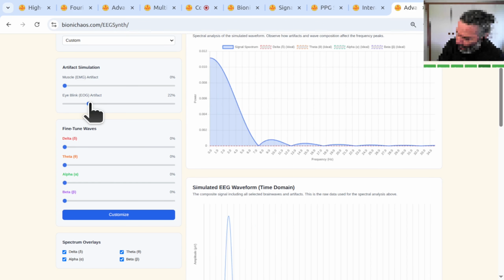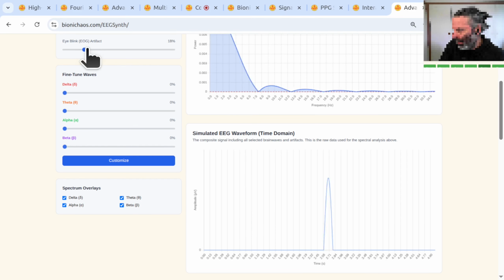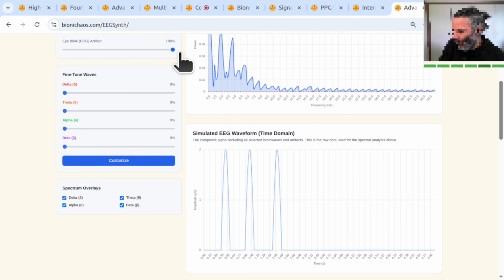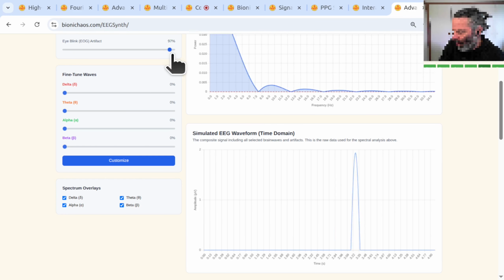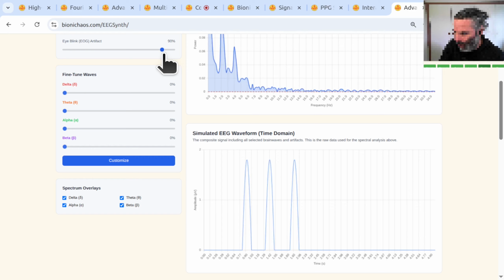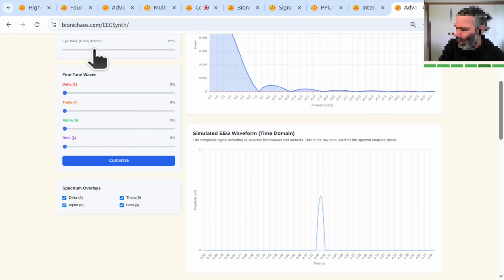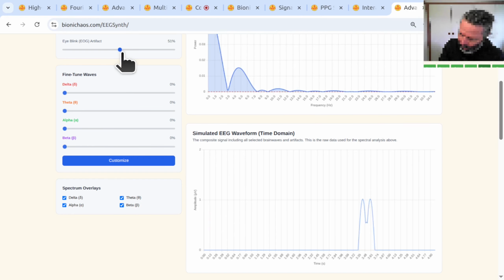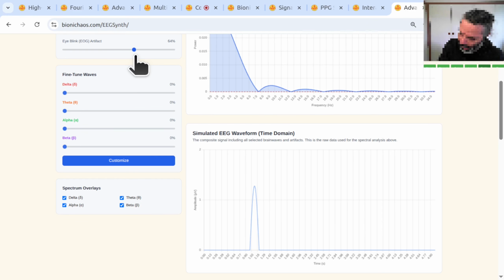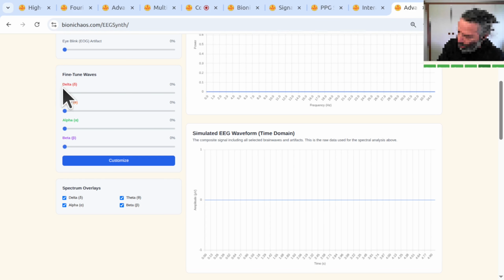And then you have those, which will be your eye blink signals, so they look like that. And now in theory you should have more of them. That doesn't seem to work as expected. Or is it just the amplitude? Oh, okay, it's the same kind of amount, a random amount of eye blinks, 2 or 3, 1 or 3, but then at a different amplitude.